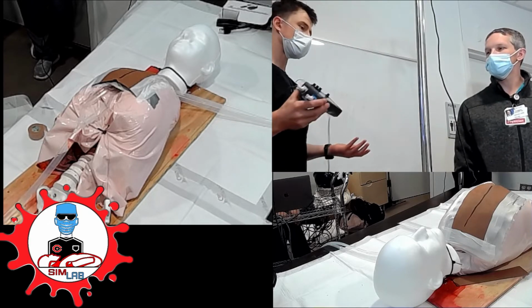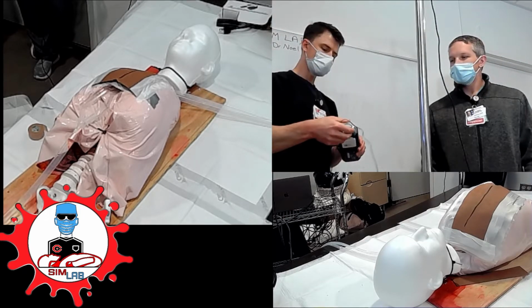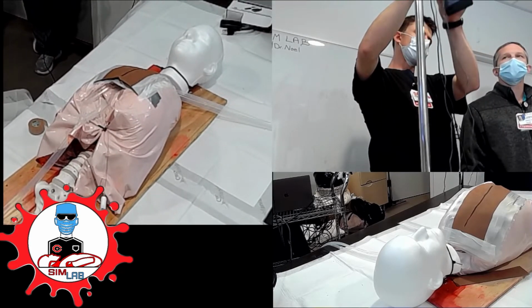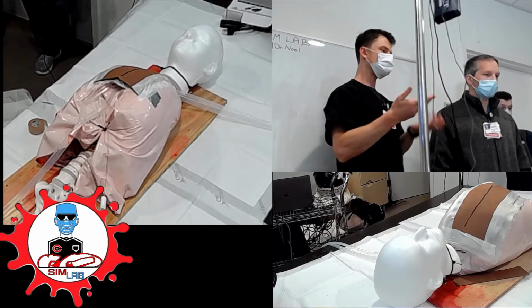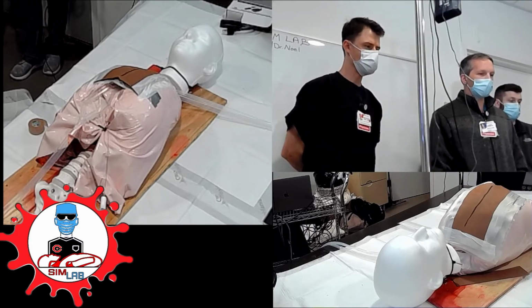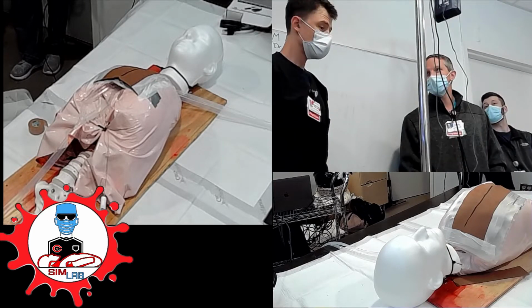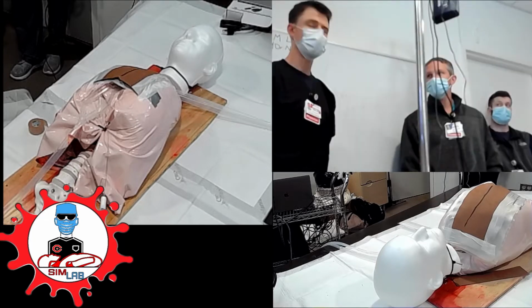Okay, so very good. So you pace them, they wake up. So one thing about the cardiac surgery patients is they come out with epicardial wires. Do you know what that means, that they're epicardial wires? Like just pace transcutaneously through the skin into the epicardium? Yeah, so they actually sew them into the epicardium, right? So you pull up the slide, Jason.